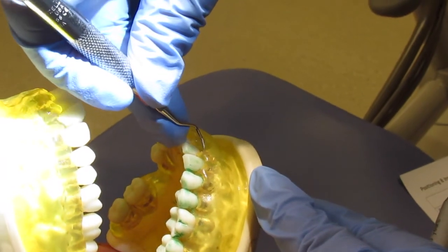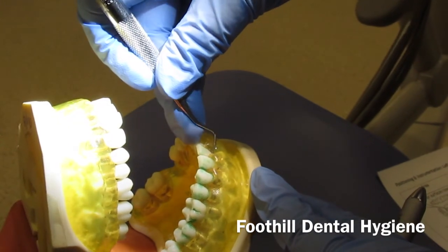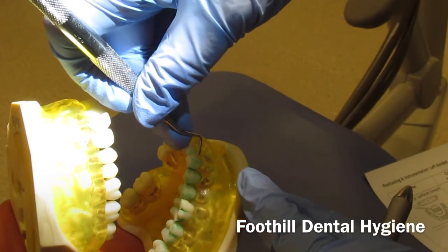Same with the next tooth. Start in the middle of the tooth, rock sideways, turn sideways, rock sideways.